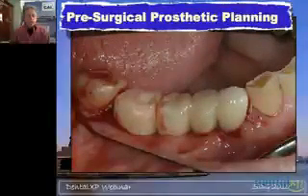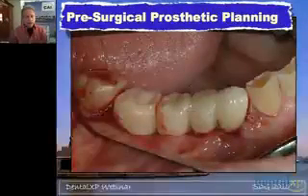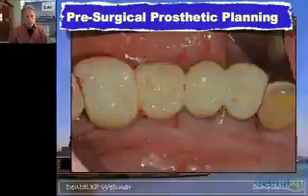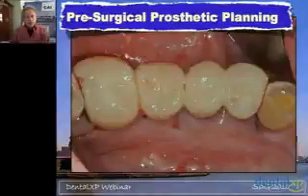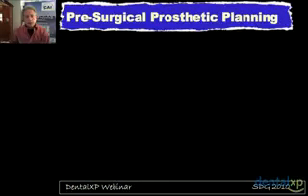Patient walks out with a fixed restoration, no more ridge lap, there's no more concavity in the vestibule. Here you see the occlusal shot from the lingual aspect. So we have good morphology, and we're going to allow this to remain in place for approximately 8 weeks before we touch it. Of course, we're going to remove the sutures prior to that.